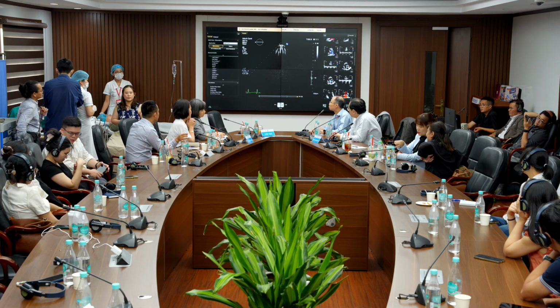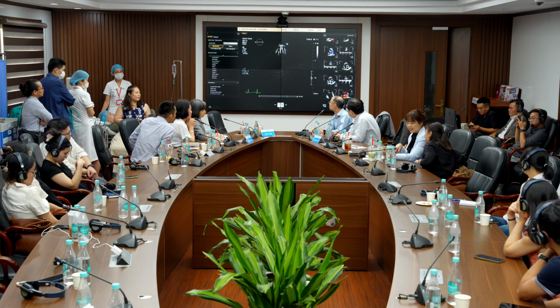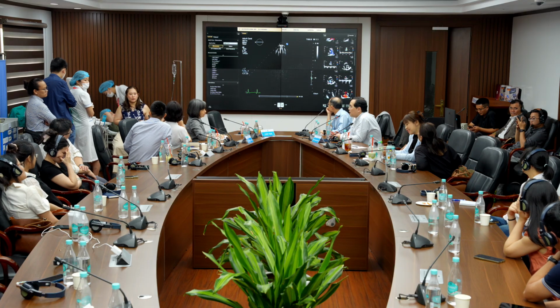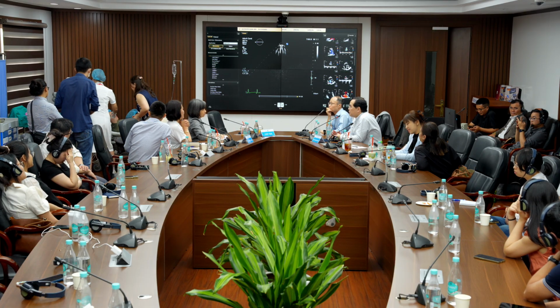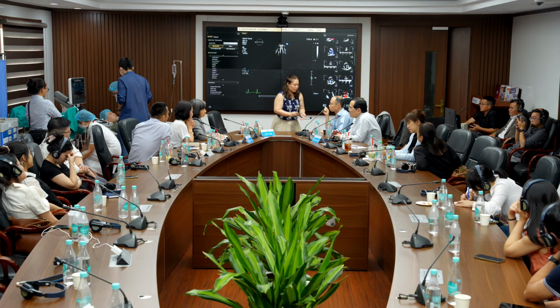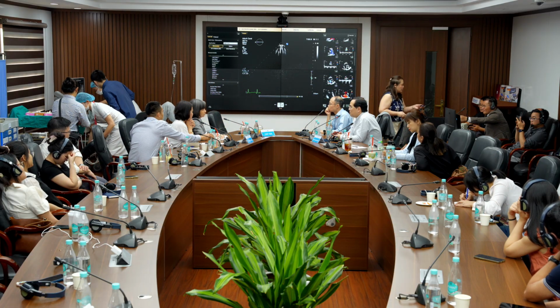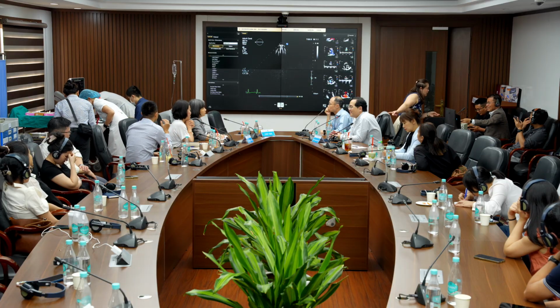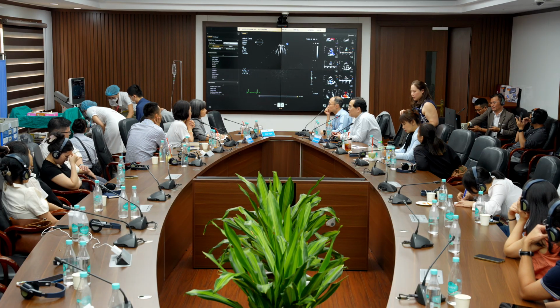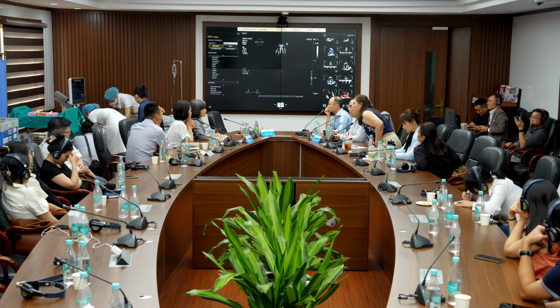Yeah. In terms of severity, Professor Raymond and I think it's probably in the moderate range, because the hepatic vein does not show any reversal. And the jet, we eyeball it, we think it is significant but not bad enough to be severe. But we haven't officially quantified it using the PISA volume method.